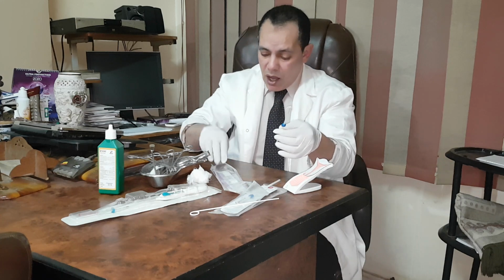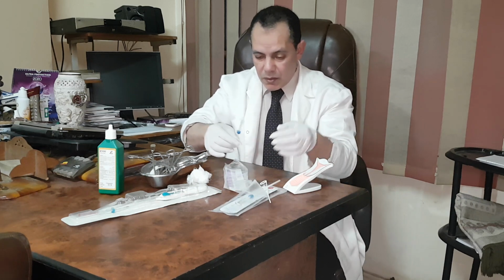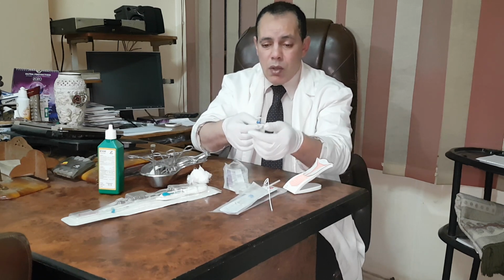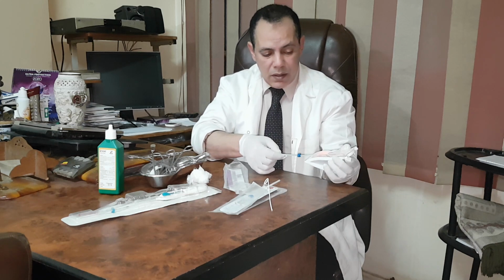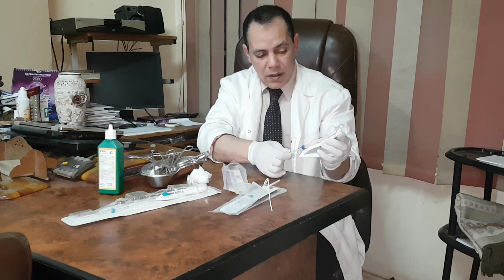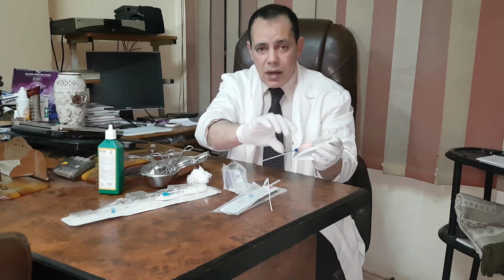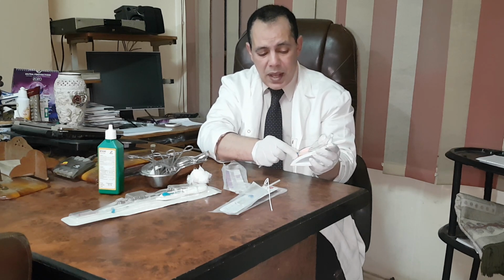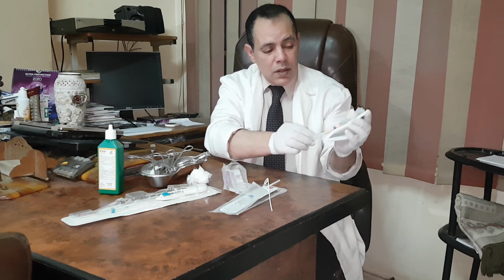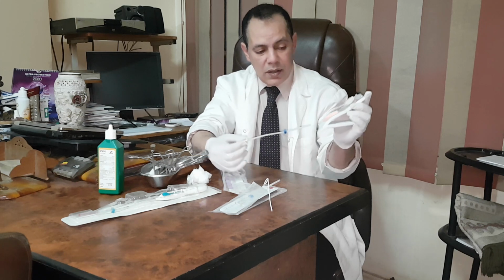This type of IUD is inserted by the pushing technique, not the withdrawal like the other one. So I insert the IUD like that. Then just push, of course after I do all the measures as previously, measuring the length of the uterine cavity and so on, and fix the flange on the measured length. Then I insert. The IUD is inside now. Then I withdraw the sheath, keeping the IUD inside.